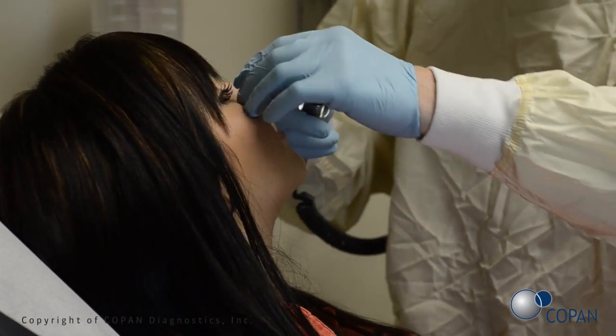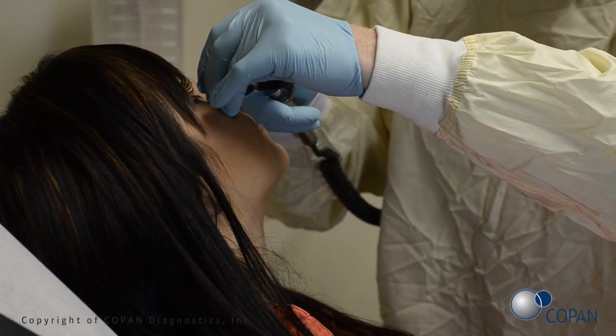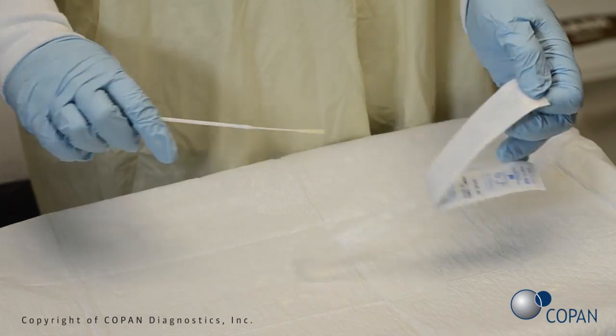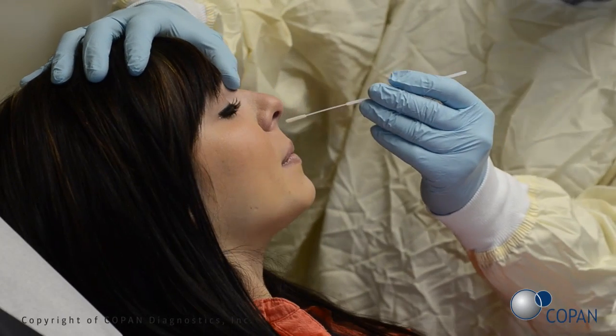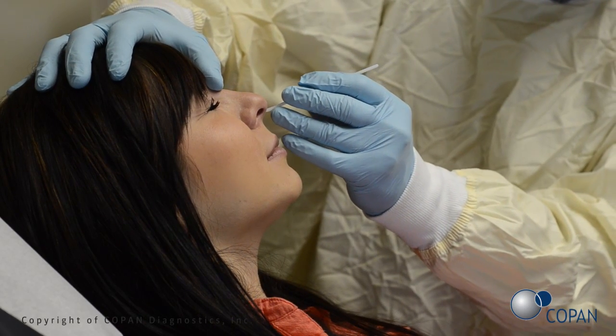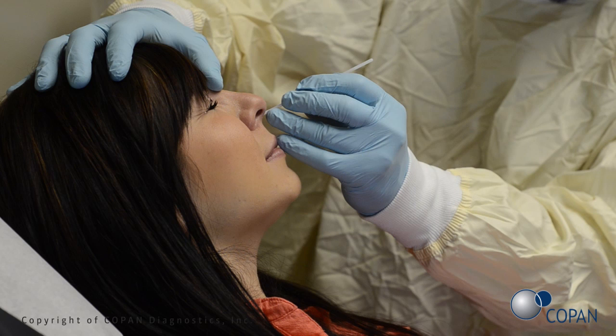Check for nasal obstructions. Open swab package. Gently insert the swab into the nostril. Using a gentle rotation, push the swab until a slight resistance is met at the level of the turbinates.